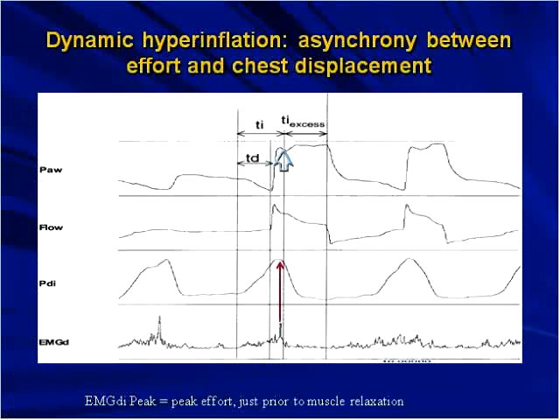Okay, I'm sorry, I kind of misspoke here. This spike here is right at the point when the diaphragm is about to turn off, and you can see that because the flow termination criteria is much greater than what the patient can interact with, we have an excessive inspiratory time that causes more air trapping.